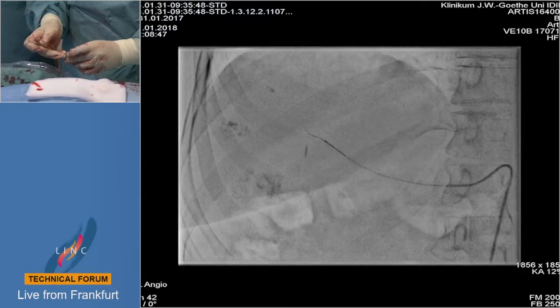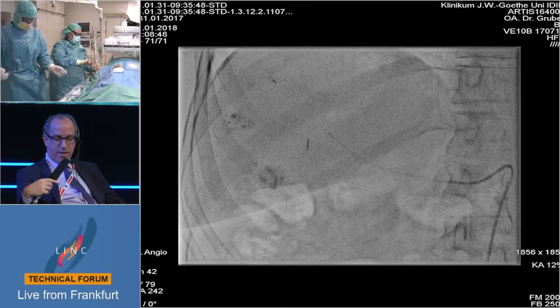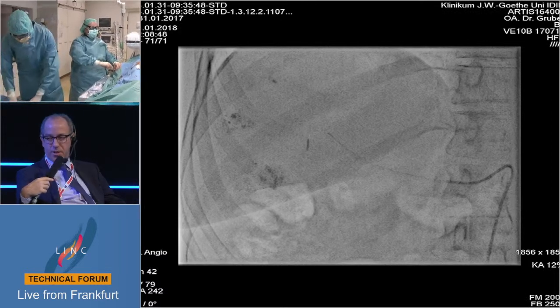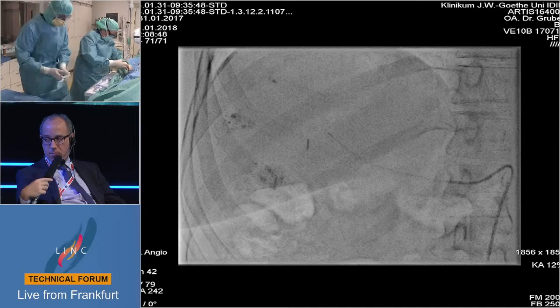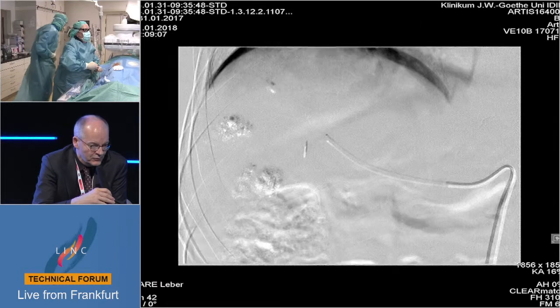So for a case like this, how frequently do you treat the patient before you would repeat the imaging? Normally we go for 3 procedures, at an interval of 4 to 6 weeks.